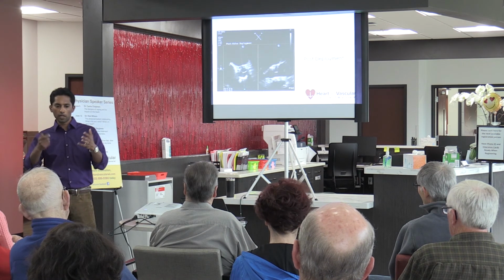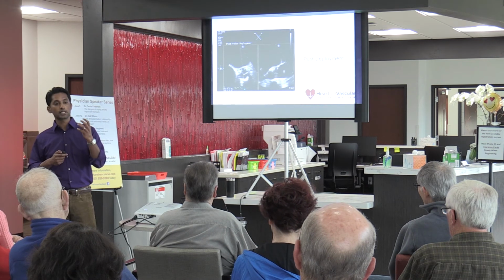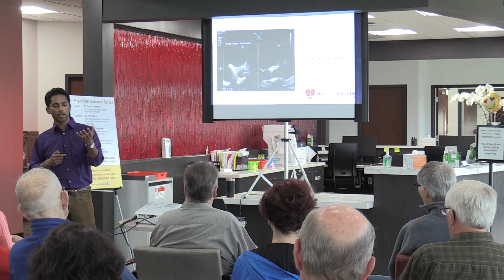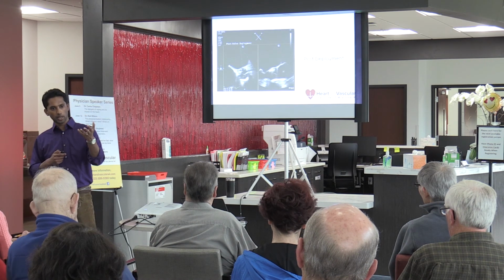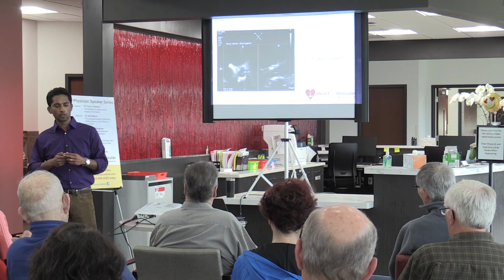And so we have these programs that tell us what size of valve we need to use, depending on what flavor of bioprosthetic valve you had put in, right? And so it figures out what the inside diameter is of the bioprosthetic valve, and then we're able to appropriately choose the right valve to go in.